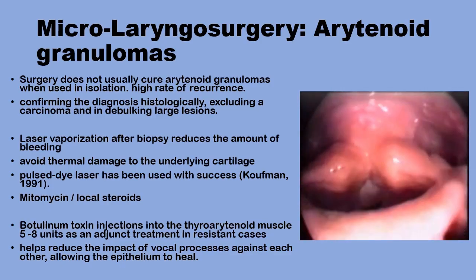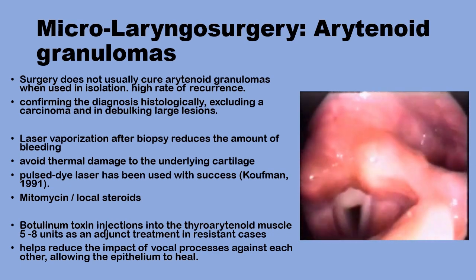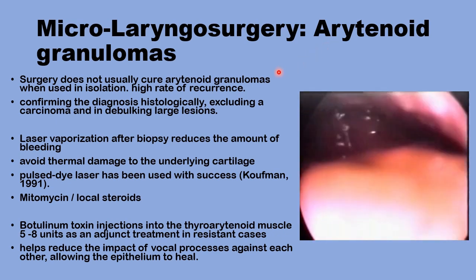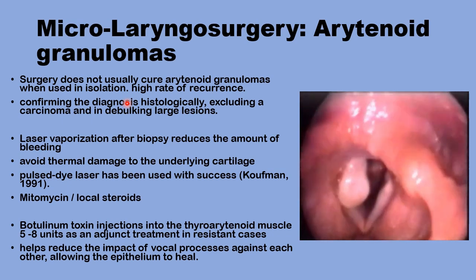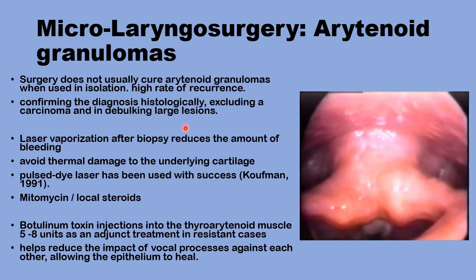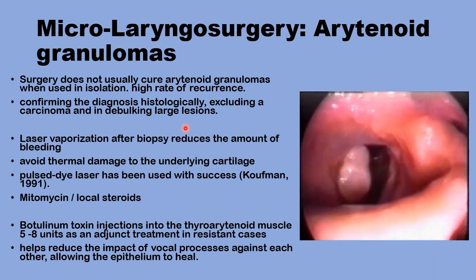Surgery in the form of microlaryngosurgery should be a last resort in the management of arytenoid granulomas. Surgery alone does not cure arytenoid granulomas, and there's a very high chance of recurrence. But surgery is helpful in confirming the diagnosis and excluding a sinister pathology, and can also be helpful in debulking a large lesion that may threaten to compromise the airway.